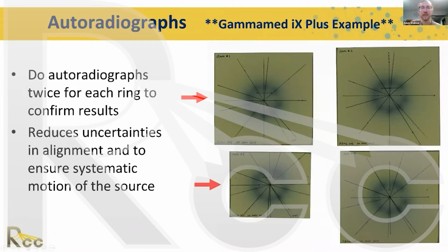So autoradiographs. So here's an example of autoradiographs. Some of these lines, this cross, and this line, and this angular line show me how to actually place the applicator. And the rest of these lines, here's one, here's one, here's one, here's one, here's one. They're splitting these dwell positions. And so I can take a measurement and know exactly what that angle is.